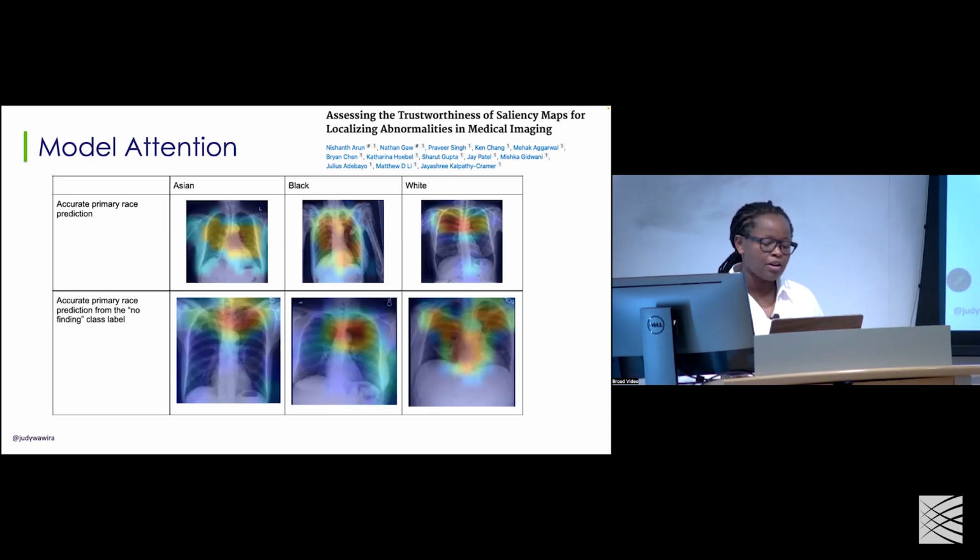And this is a really good paper and presents an area of work that needs to be developed, which is understanding the utility of saliency maps. People who've looked at it found that even just by changing the order of these labels, you get different saliency features. So this is an open area. I just put them there because you cannot publish a paper without including some form of visual showing where the model was looking, even if it's not very helpful.